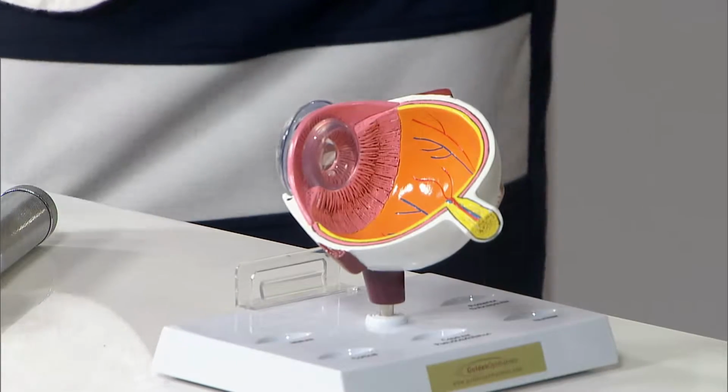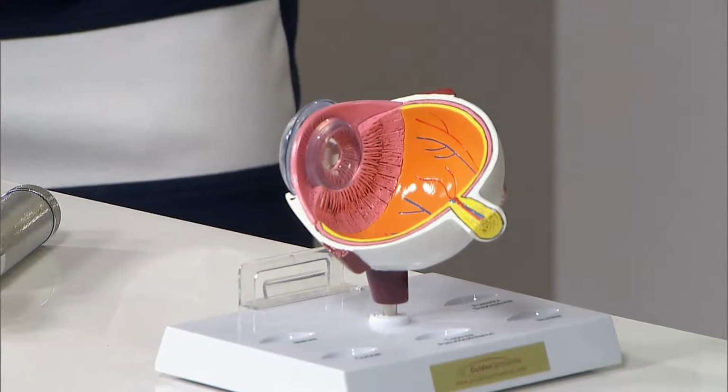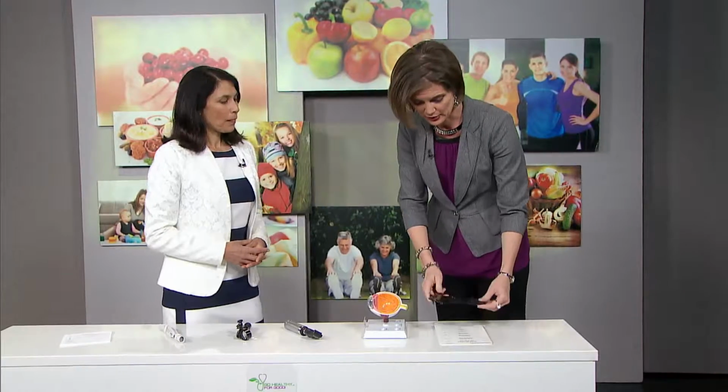So the very first thing that I do in the eye exam is to check the visual acuity. And that is done usually with something that looks like this. And usually if somebody does wear glasses, I want to know how good their vision is with the best glasses prescription they can have. And so I would ask them usually to hold it up like this and to look at an eye chart either on the wall or a near vision card like this, and we would check each eye individually because it is important to know if both eyes are working properly. Because they can be quite different sometimes.